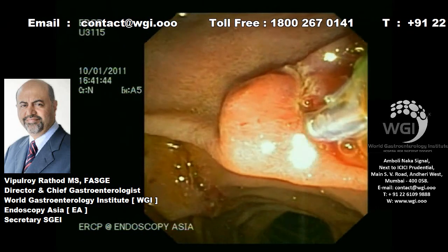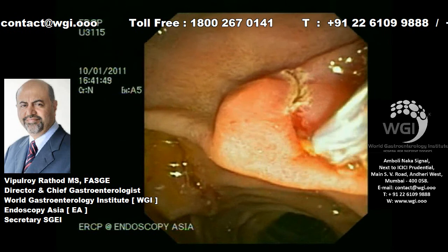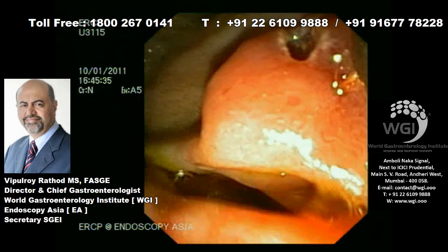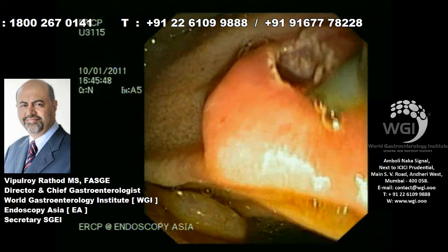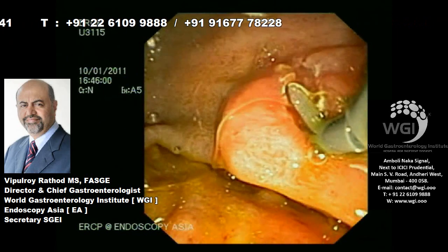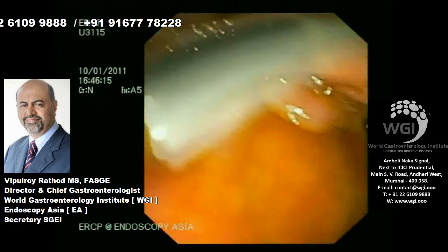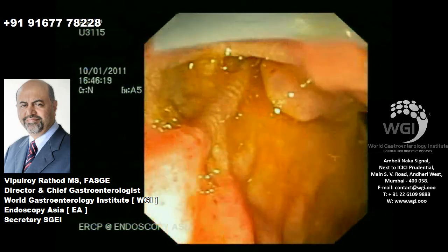We need to leave a small stent for a while for effective ductal decompression. This patient will definitely require an ESWL session — we will call the patient back after six weeks. The stent is in place. Major and minor papilla sphincterotomies are done, and this should keep the patient asymptomatic.